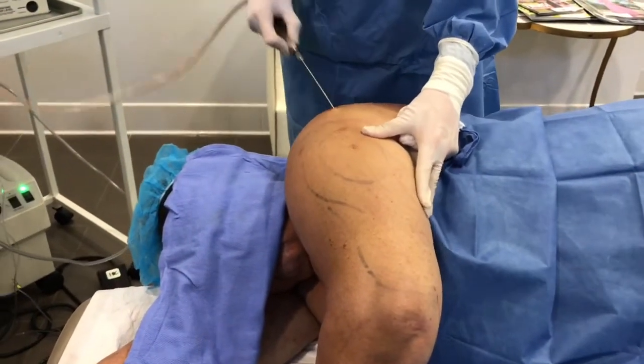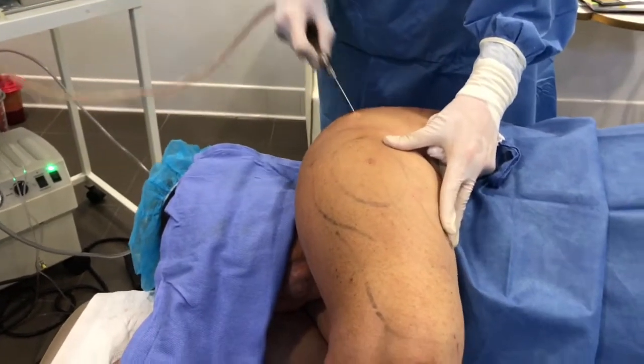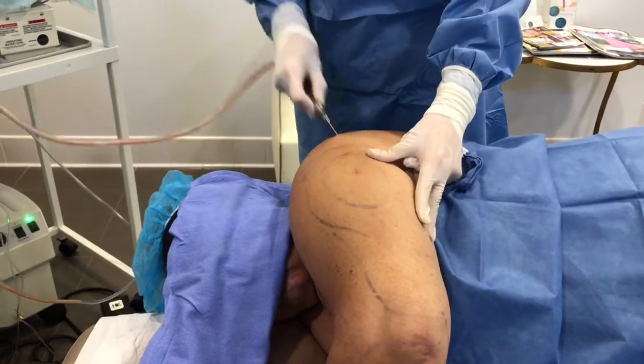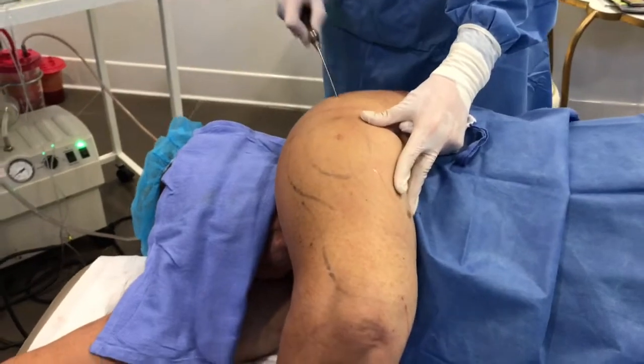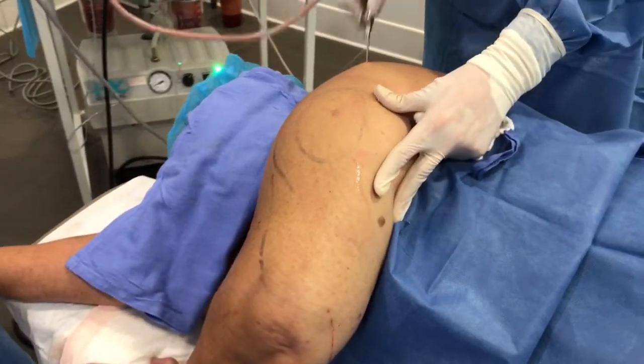If you take a look at our little tubing that removes the fat, you can see that pretty beautiful yellow color of really healthy fat. So we know that we're doing a great job as we actually remove the fat. What's important is when we do it under just local numbing, we're using smaller instruments, which means more precision and less chance of an irregularity.